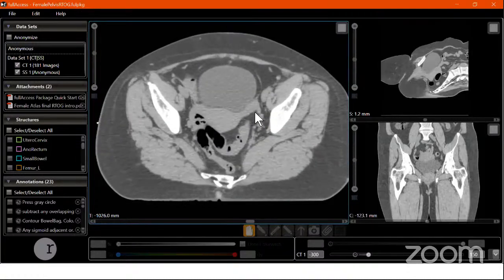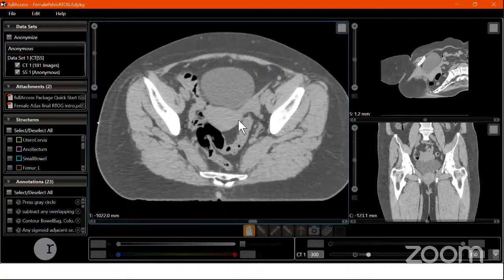There is some controversy whether to include the ovaries or not, because the involvement of ovaries ranges from 1 to 3% in all historical studies, which is very minimal. But since we are not causing any great harm in a postmenopausal patient by including ovaries, we continue the practice. Of course, this practice has to be revised when we are treating younger patients. Till now, we don't have any clear guideline on whether by avoiding ovaries we would achieve the same tumor control or not. So we don't have any answer for that.